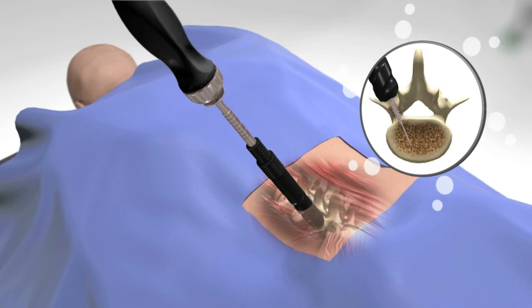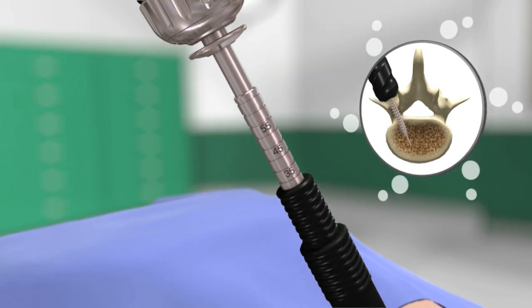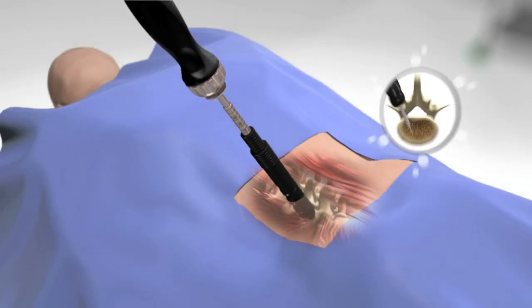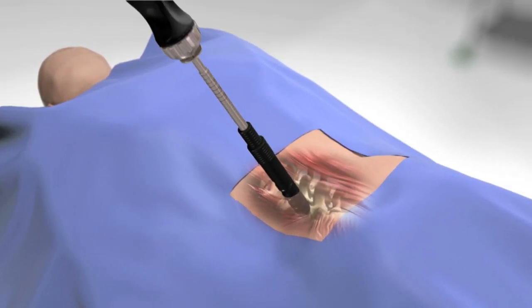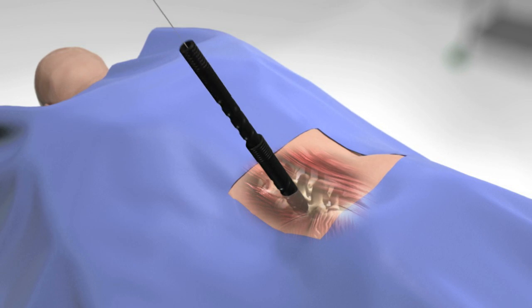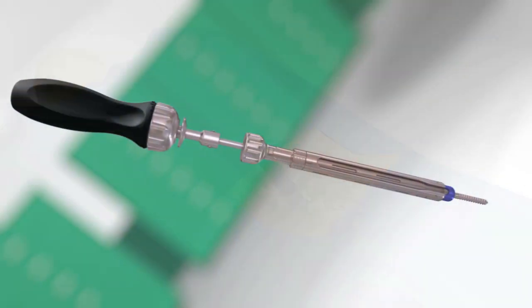Approximate screw length can be determined by looking at the screw length indicator at the proximal end of the cap. Upon completion of tapping and screw length determination, remove the tap and dilator three while leaving dilator four in place.